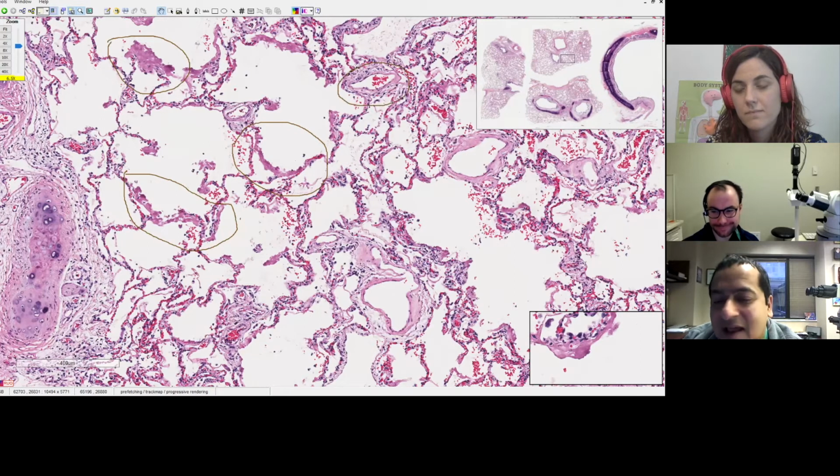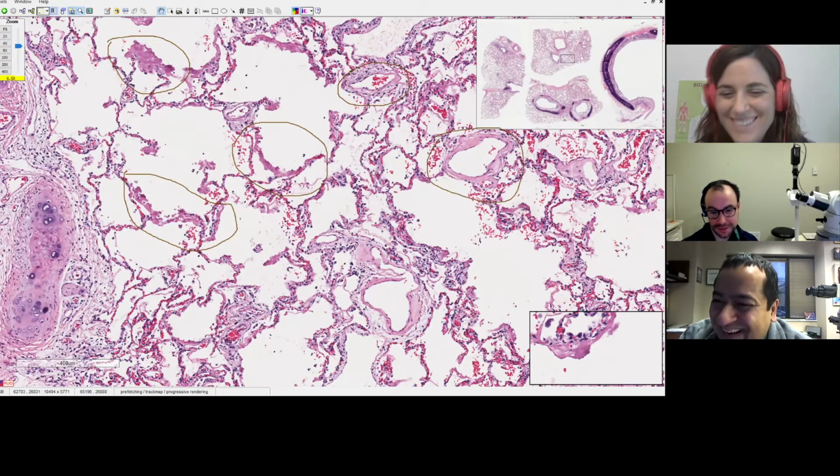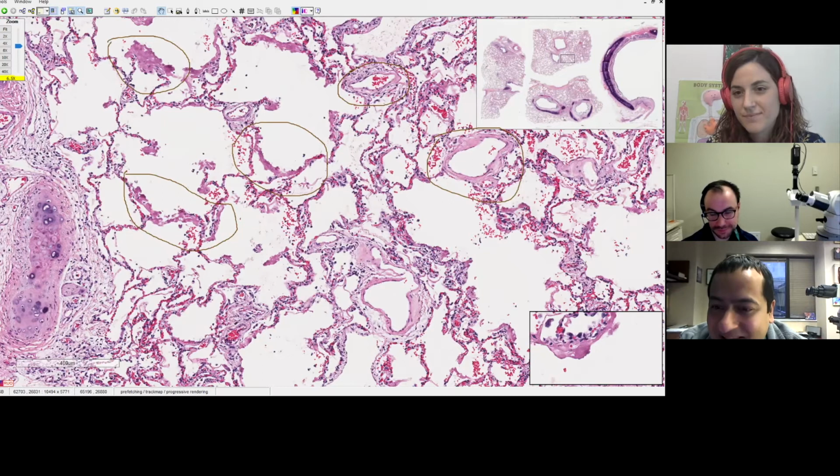And again, I think there's such a divide here among pathologists. Some people feel that every case of COVID has to have thrombi in it, has to have diffuse pulmonary microthrombi, and that explains the shunt and the odd symptoms and this and that. I agree with all of that theory. But let me just circle the blood vessel for you. Okay, so I completely agree with the theory, but in practice, this blood vessel is normal.